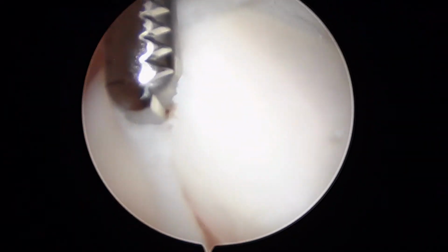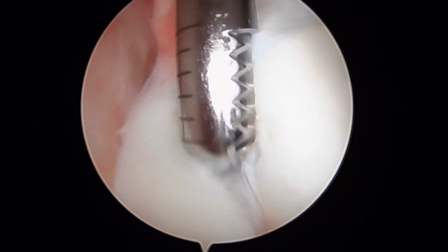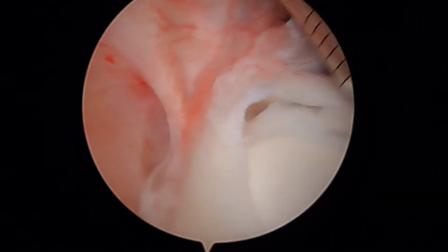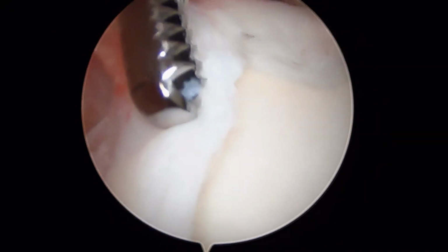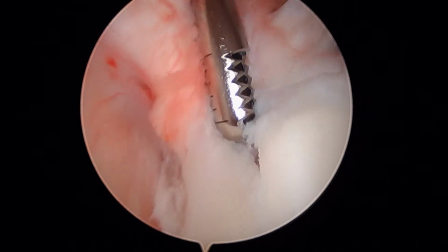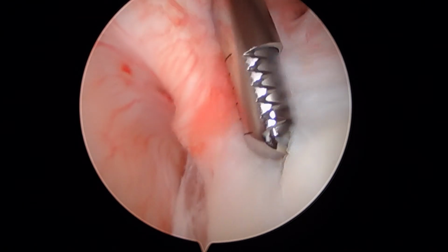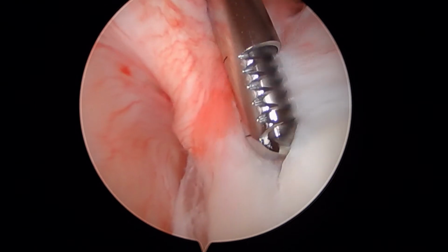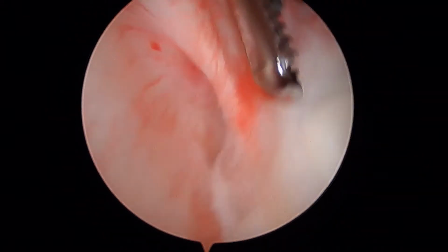So I recognize we've taken off the biceps tendon, so the question is, why are we doing this? The reason is this labral tear is so extensive that in probing it and looking at your shoulder motion, it looked like it was still going to potentially get caught in the joint. See how it was unstable like that and could displace into the joint? And when we rotate your shoulder, we know that that can happen. So we're going to anchor this down and take care of that problem for you. So that looks pretty good there.